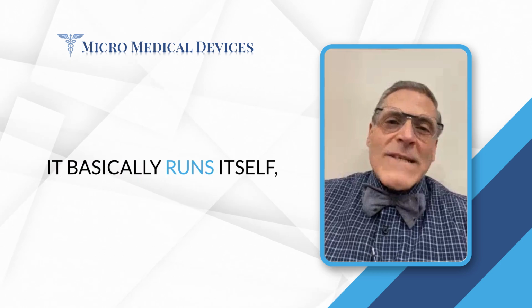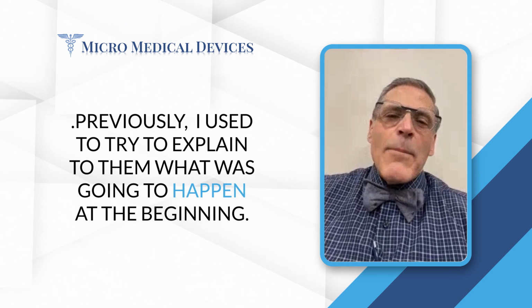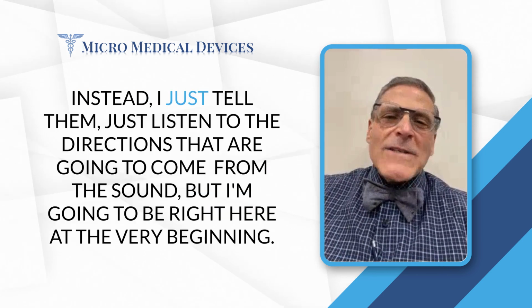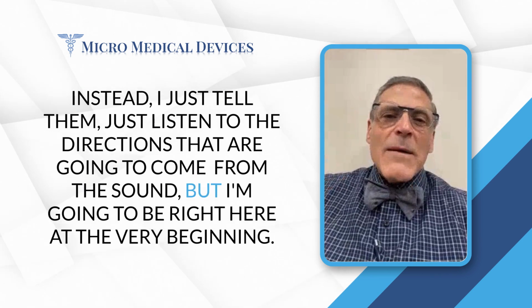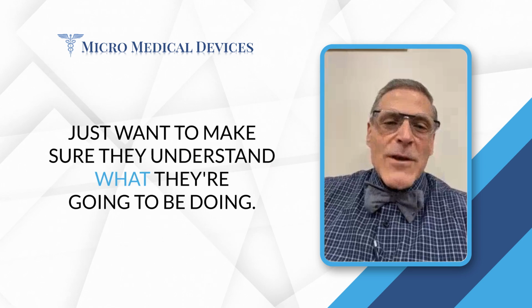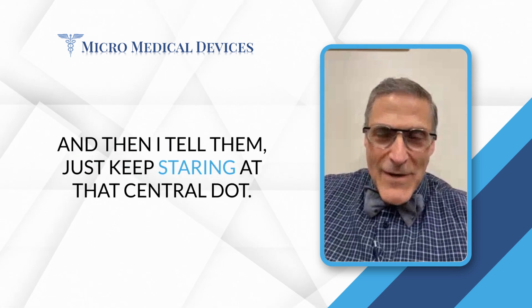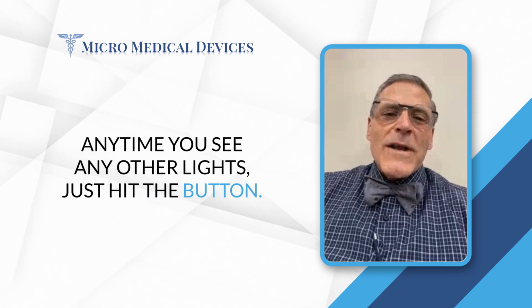It basically runs itself. Previously, I used to try to explain to them what was going to happen at the beginning. Instead, I just tell them, just listen, the directions are going to come from the sound, but I'm going to be right here at the very beginning. I just want to make sure they understand what they're going to be doing. And then I tell them, just keep staring at that central dot. Anytime you see any other lights, just hit the button.